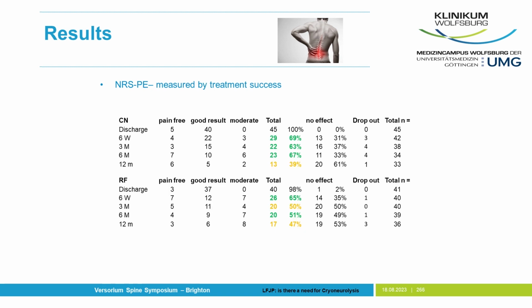Under physical exertion, the cryo seems to be much better because we have good results for 6 weeks, 3 months and 6 months, and moderate after 12 months. The radiofrequency differs a little bit. 6 weeks was good, 3 months moderate, 6 months really good, and 12 months moderate.